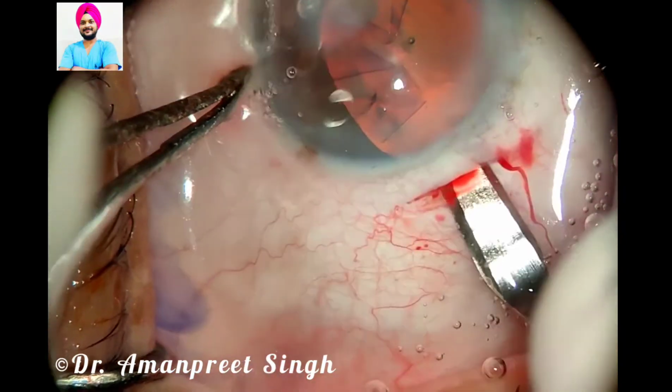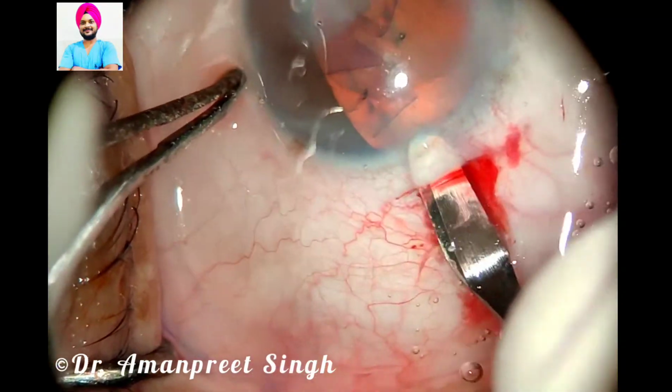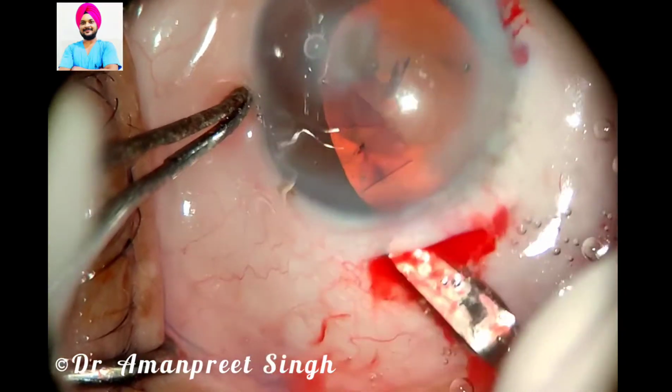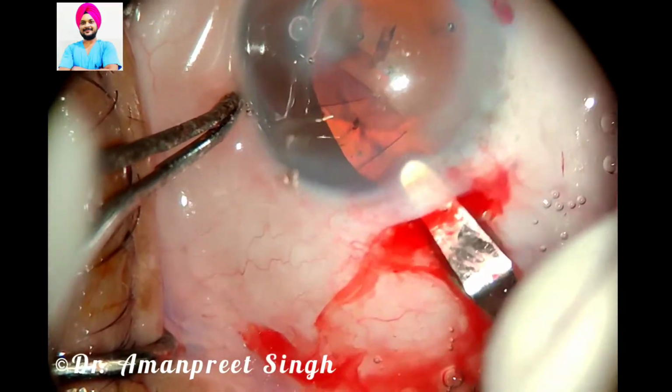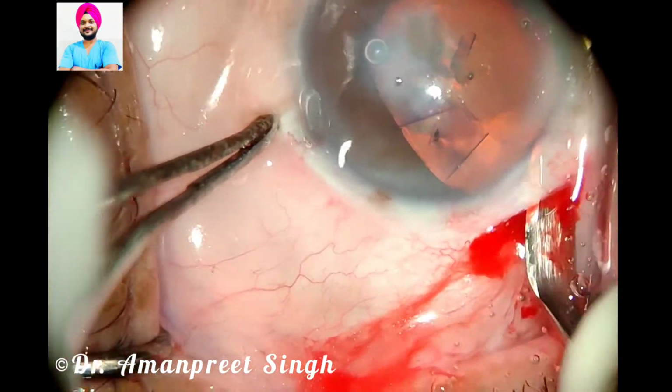We are going inside the corneal stroma and enlarging that tunnel to the sides and making the scleral pockets to the left and also then to the right. So with this we have formed a very good scleral tunnel.